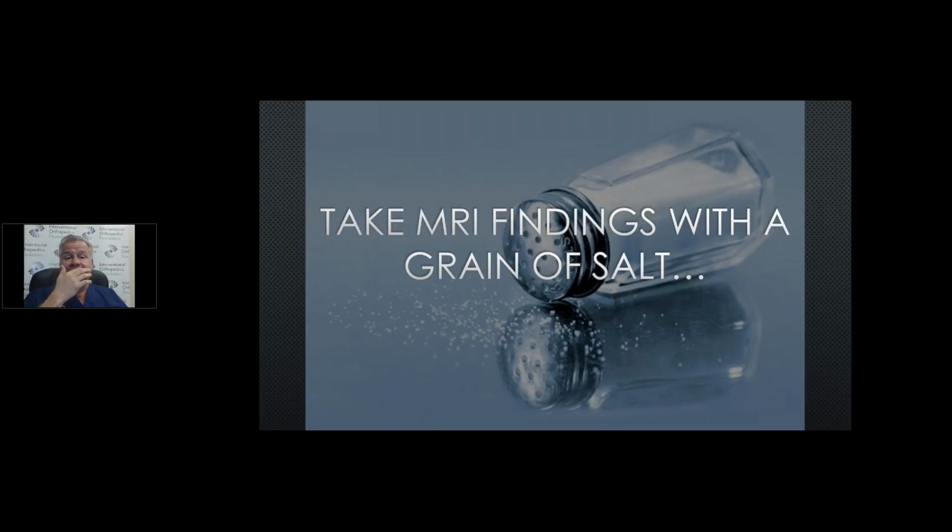So before we get started into all of this, you need to take MRI findings with a grain of salt. And what I mean by that is that, regrettably, there are many studies, almost too numerous to list, which is the reason why I didn't list them here, that state that some MRI findings could be related to pain. Most MRI findings aren't necessarily related to pain.